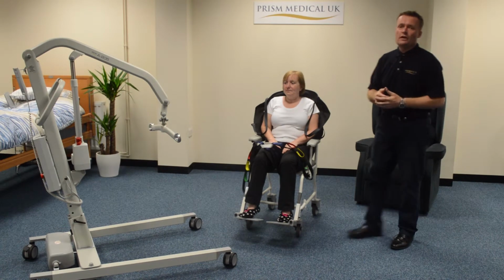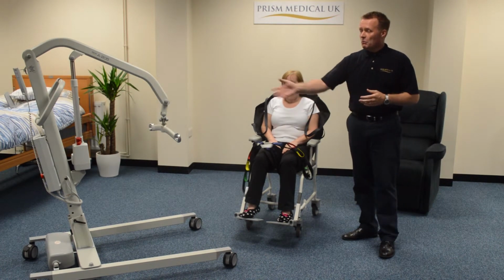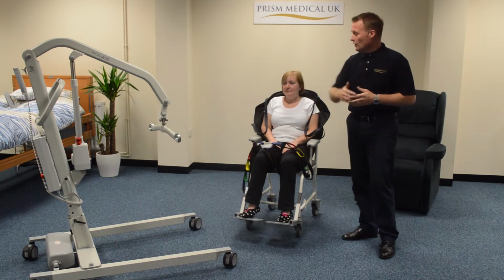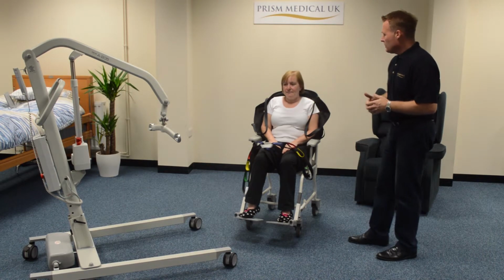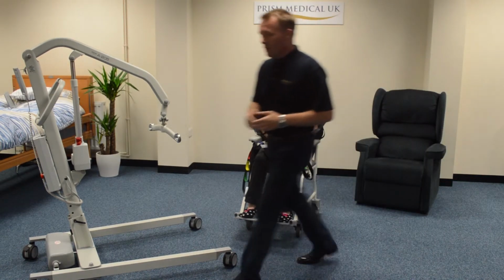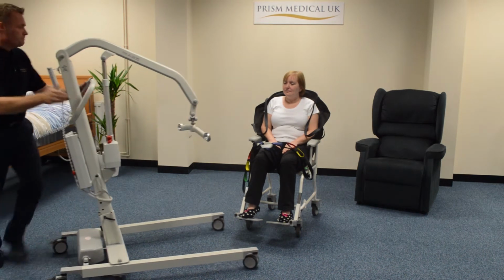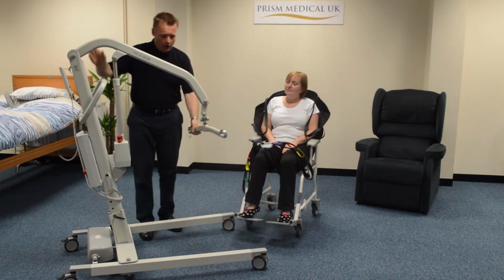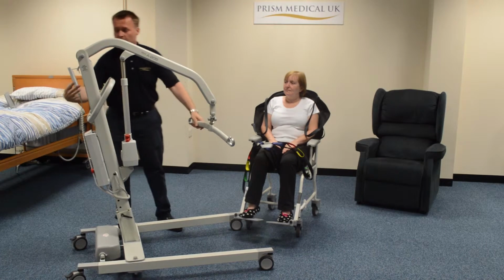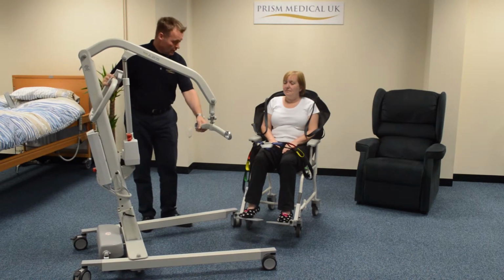And now we're going to show the Prism A-205 mobile hoist in use. So what I'm going to do now, I'm going to use the hoist to transfer Mary here from her shower chair onto her favourite armchair. So what we'll do to start with is we'll bring the hoist into position, keeping control of the carry bar at all times, and we open the legs to enable it to go around the shower chair.